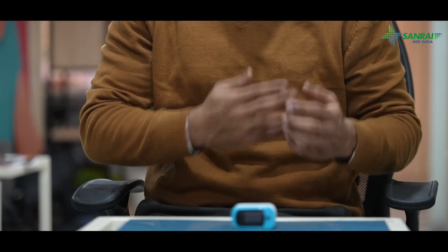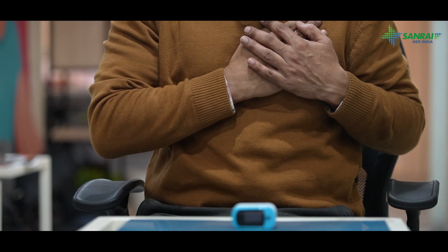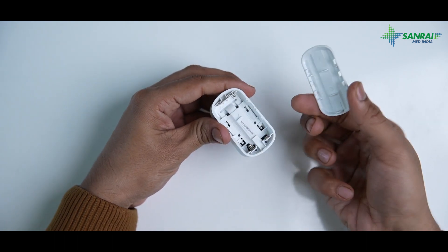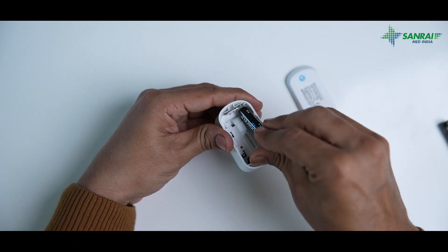Put your hands on your chest at heart level and hold them still for a moment. Then begin by removing the back cap from the battery chamber and inserting the batteries.